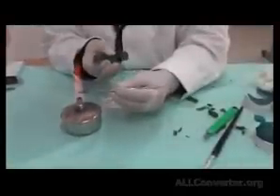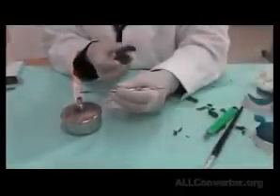And if I invert this and take it out, I can find that the border is now continuous from left to right, which I am now recording on the cast, but in the patient's mouth, I would have finished recording the functional depth of the cast.